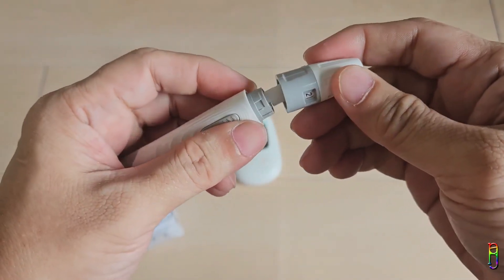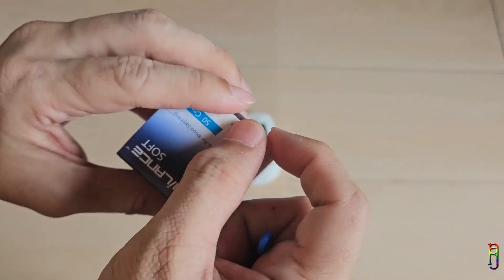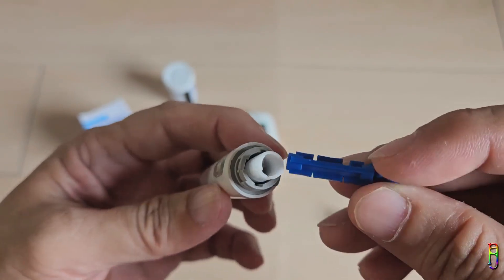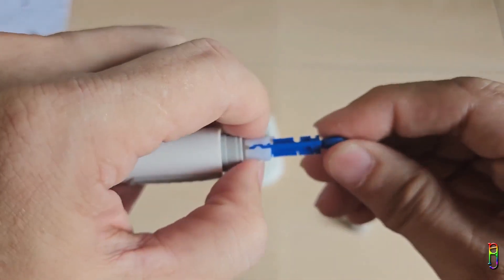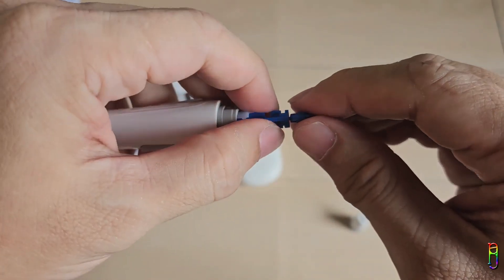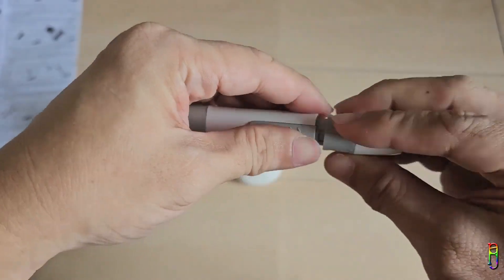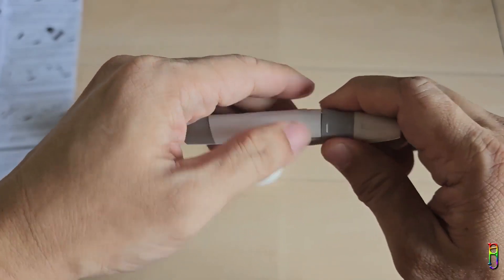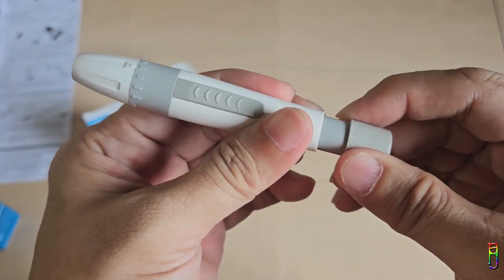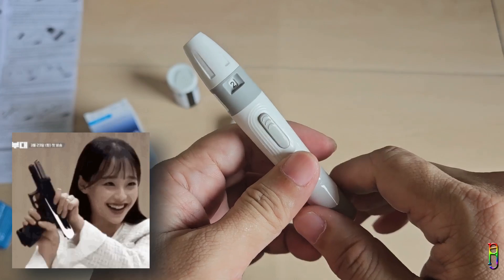Time to test this — first, set up the lancing pen. Twist the top counterclockwise to remove it, then get one lancet — a sterile needle used to prick the finger. The flat circle side is the cap for the needle, so stick the cylindrical side into the white plastic spot in the lancing device. When you hear a click, that means you've loaded the lancing device. Twist the flat circle from the lancet to remove it and reveal the needle, then put the top part of the lancing device back on and twist clockwise.